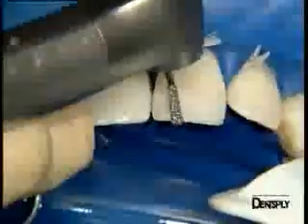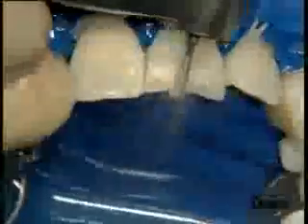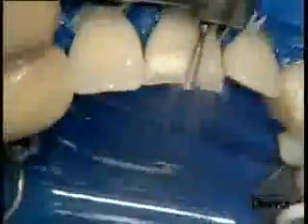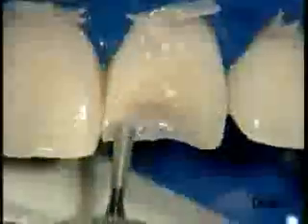The old composite resin restoration is then removed, using a pear-shaped burr, reference 830. The translucency of the composite resin allows the dental tissues to be clearly differentiated from the filling material. The closer we get to the dentine, the more carefully we proceed. With small moves, we must take precautions so as not to damage the enamel of the neighbouring tooth.